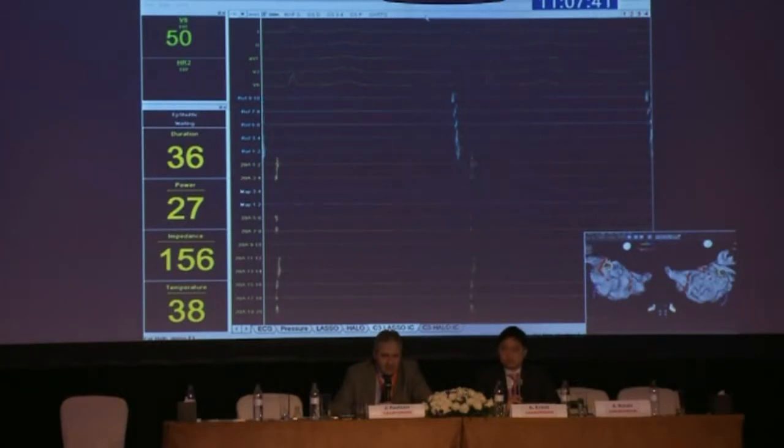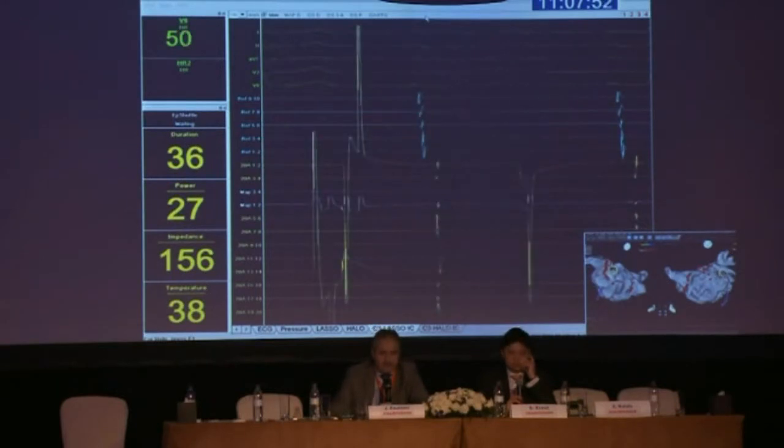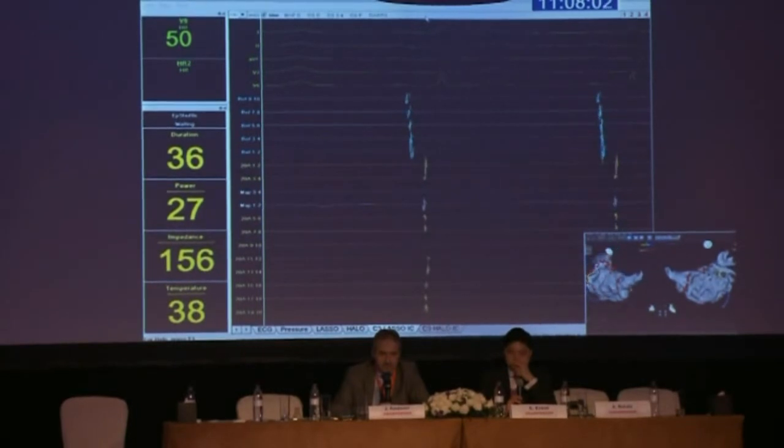So I'm just going to explore around the vein. I've put the mapping signal right next to 5.6 to allow me to time it without having to ask Neil, our gorgeous technician, to continually update the timings for me. And you can see as I come up the back wall here, the timing of the map appears to be getting relatively earlier.